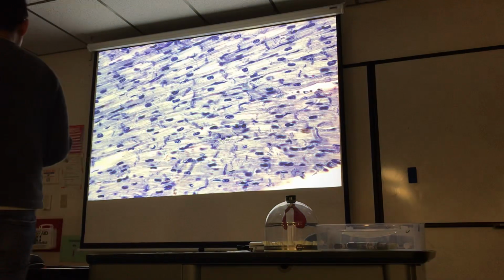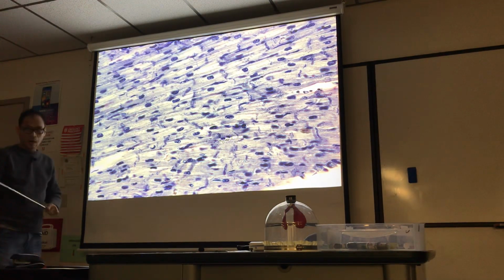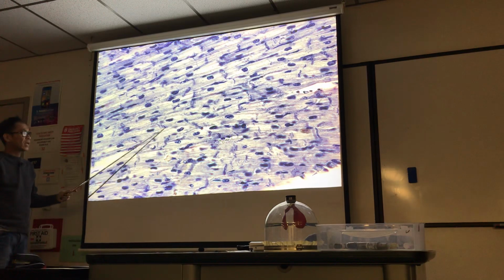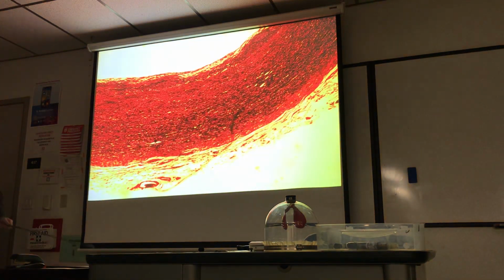Right, this tissue type is cardiac muscle. Cardiac muscle, and I might ask you to identify any of these little dark bars, intercalated discs. The heart pumps blood into the arteries closest to the heart. This is an elastic artery.